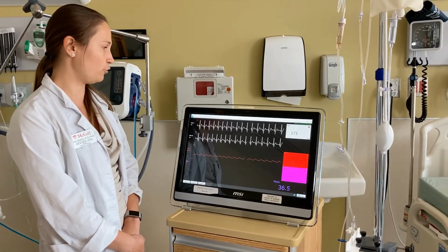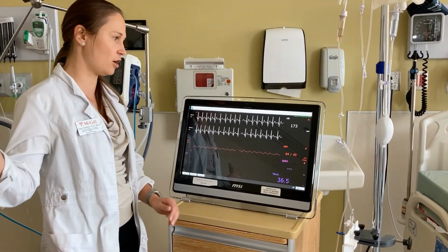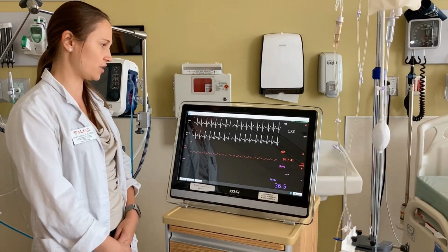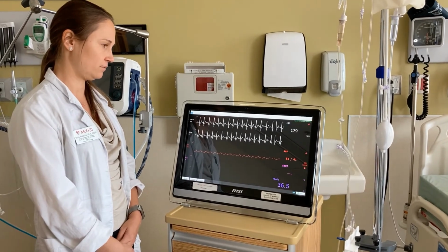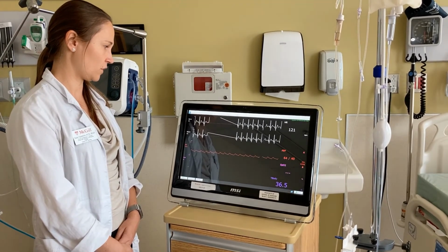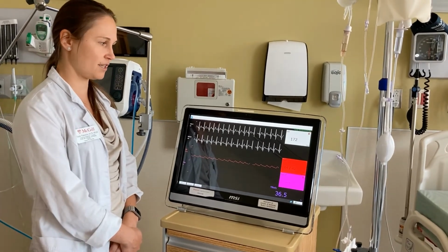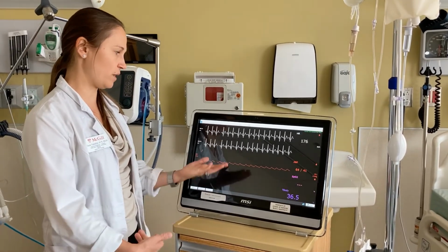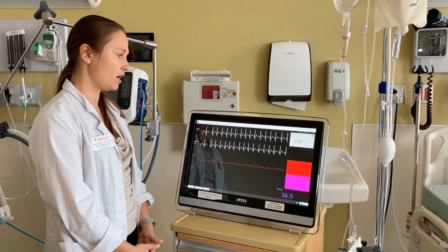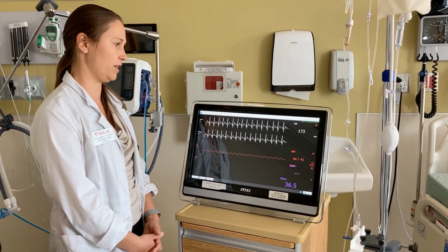So now if we proceed with cardioversion for this patient, and my colleague is actually taking care of the defibrillator, we're just going to look at the monitor and see what happens if this patient is cardioverted. So you will see the same jump, you will see a period of asystole after a rise in electricity. Unfortunately for this patient, the cardioversion didn't work, so the patient went back into their tachydysrhythmia. In this case, we will continue with CPR as needed and follow the ACLS guidelines.